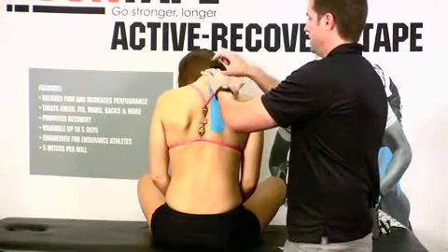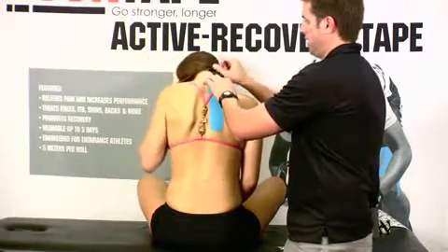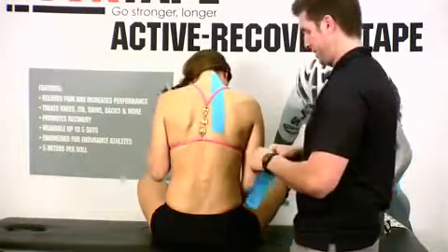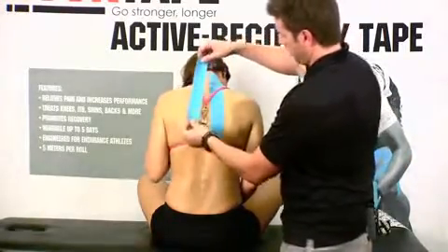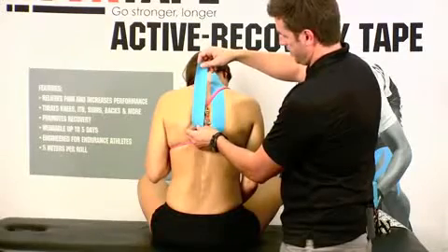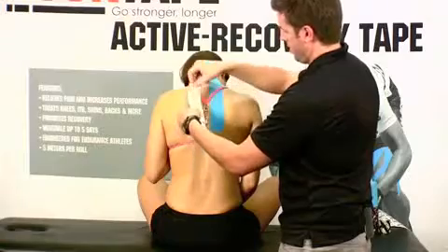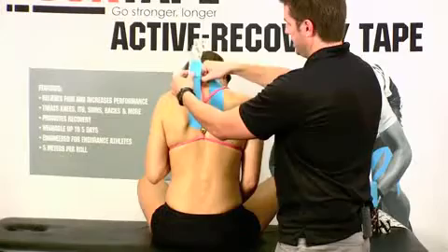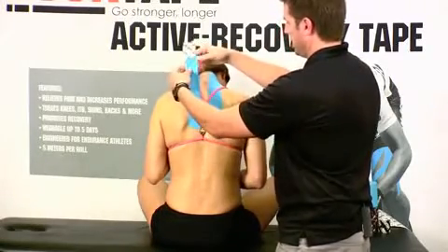How high you go depends on your patient's position and where that pain level is. Second piece — I'm just going to repeat what we did on that right side, trying to be as symmetric as possible. When you pull at a 10, 15, or 20 percent pull rate, you want to make sure you're doing the same thing on both sides.